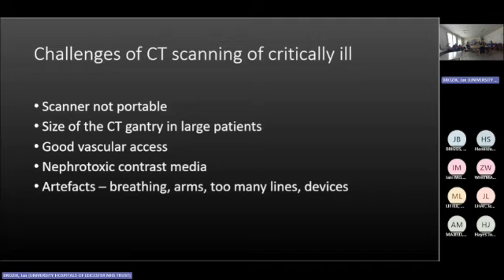We are giving nephrotoxic contrast media. Usually it's on the floor. Happy to, there is. I still would say question what the clinical question is. Maybe to answer it, you don't need contrast. That's another thing. In most of the cases, we do contrast.